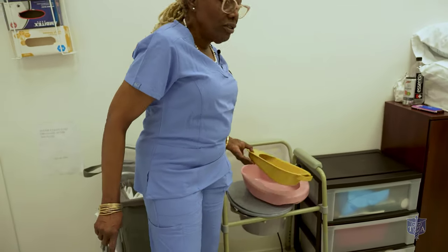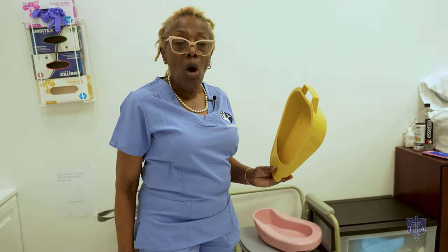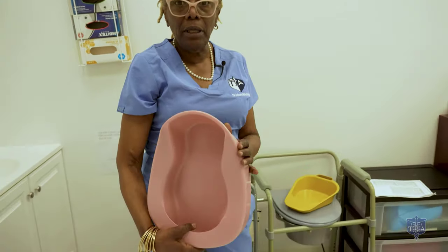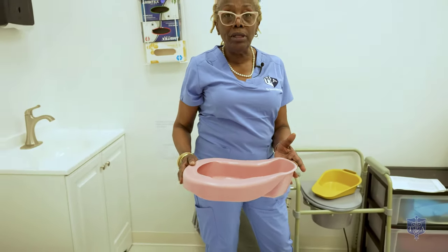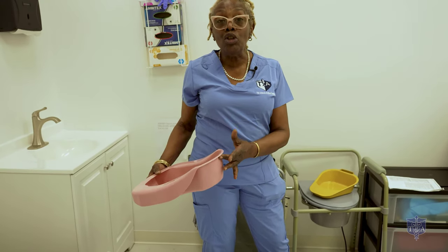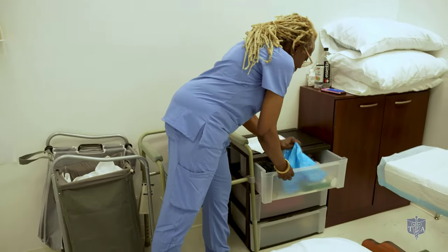We're going to do the skill of giving the bedpan. Our equipment is as follows. This is called a fracture bedpan — it is used for people who have a broken hip or spinal surgery. This bedpan is your standard bedpan that we use. Women use the bedpan to urinate and have a bowel movement, but men only use the bedpan to have a bowel movement; they use a urinal to urinate. For this skill, we also need a blue pad.